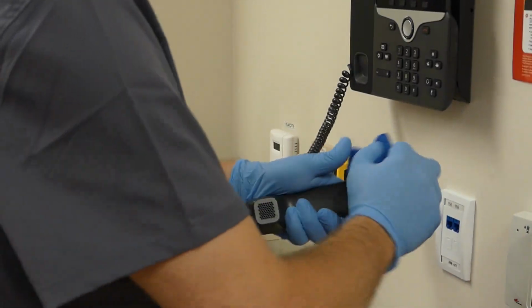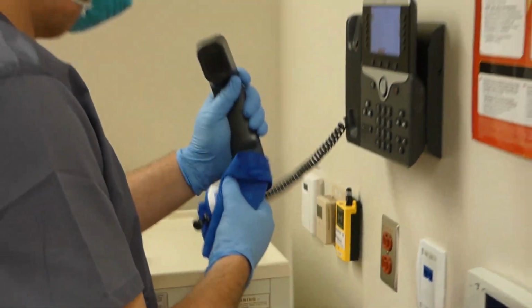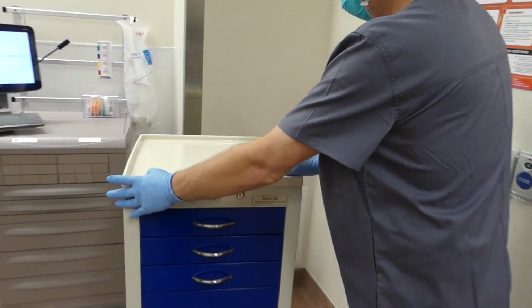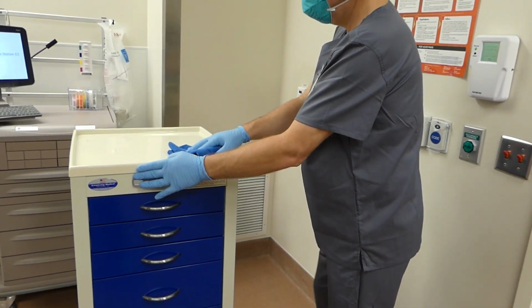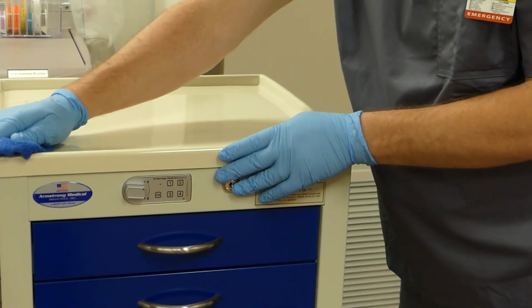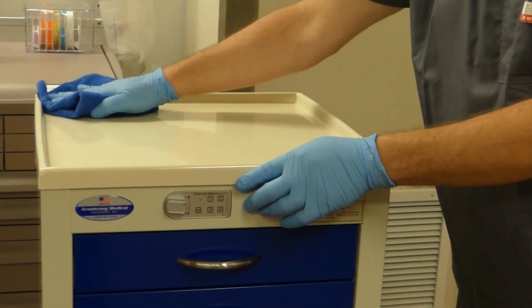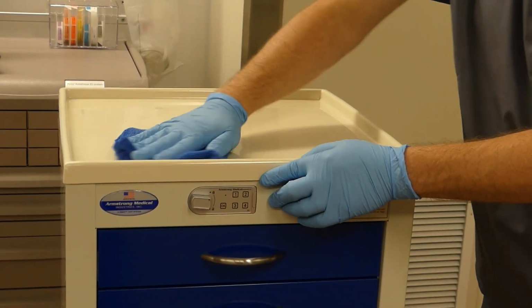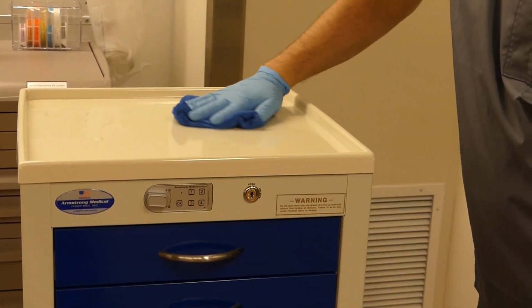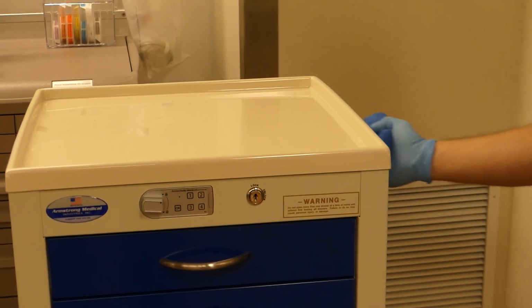Use one side of the wiper to clean and disinfect a separate surface for a total of 8 surfaces per wiper. Each piece of equipment will be moved to the center of the room as it is cleaned. Each item should be cleaned from top to bottom, cleanest to dirtiest, in a clockwise or counterclockwise format, using the S stroke when using the wiper, with effective palm pressure.